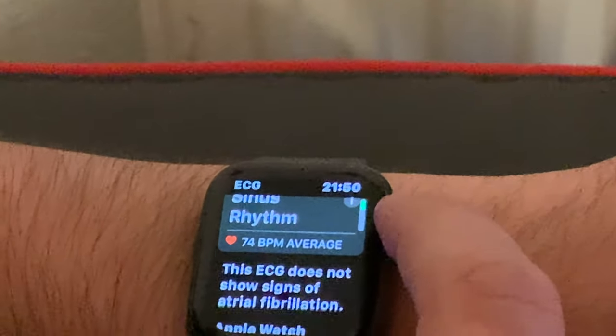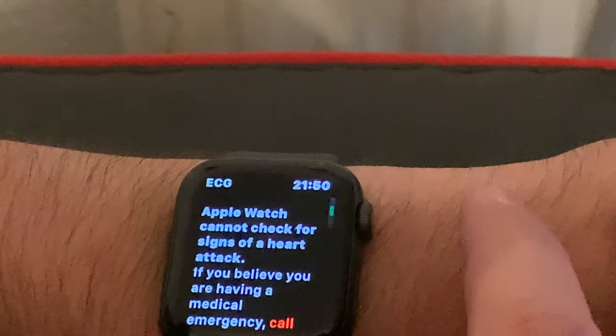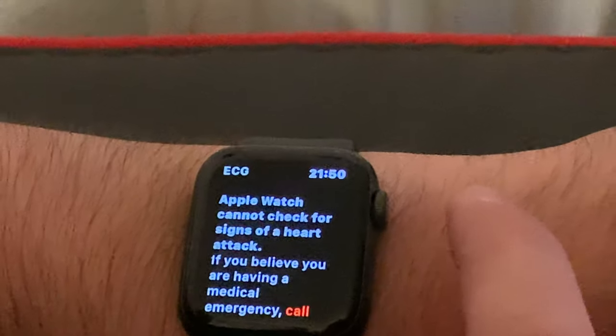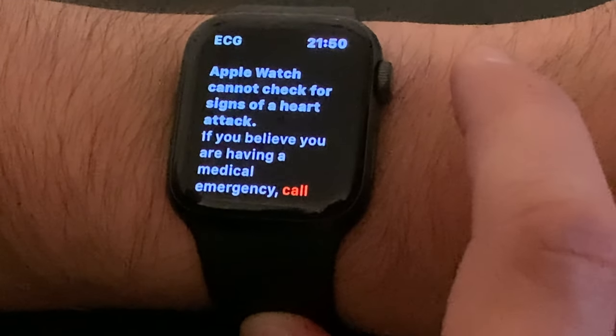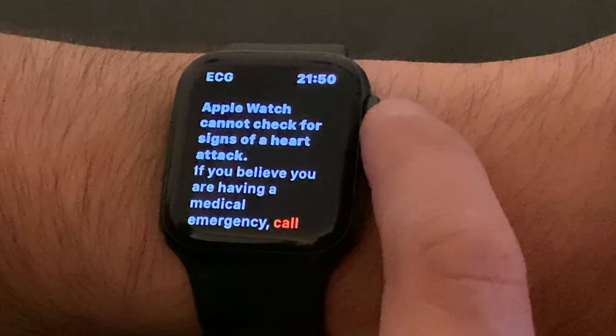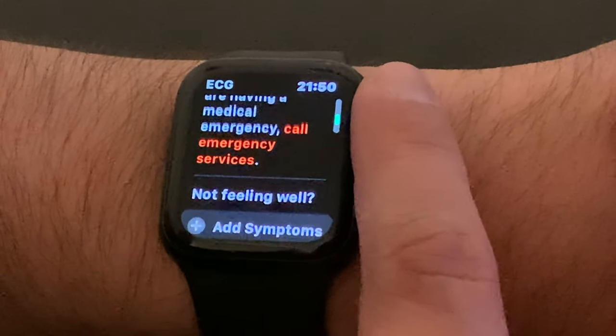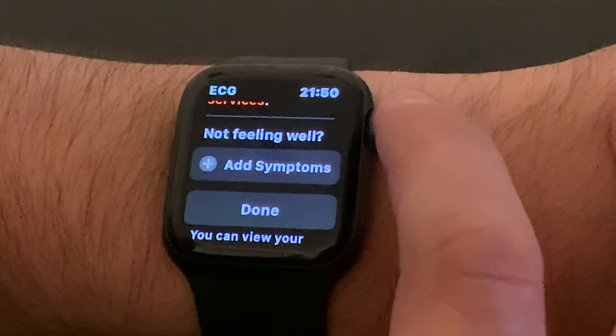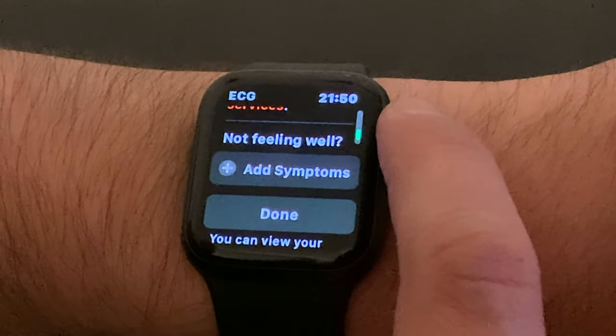You can see here that it says the Apple Watch cannot check for signs of a heart attack, and if you believe you're having a medical emergency, to call the emergency services on the relevant number. It also gives you the option that if you're not feeling well but you've still done the ECG and got the results, you can add symptoms yourself in the health app on your iPhone.